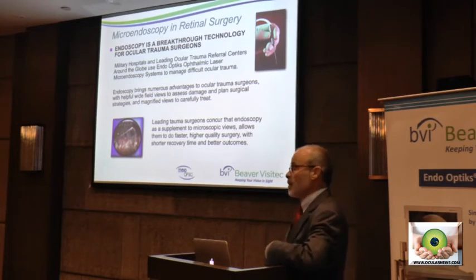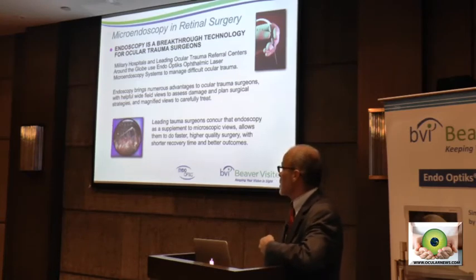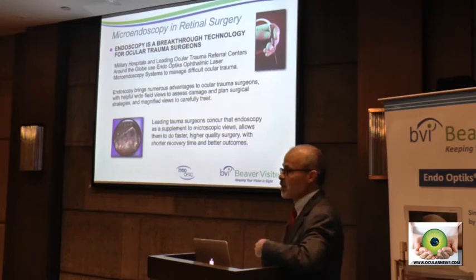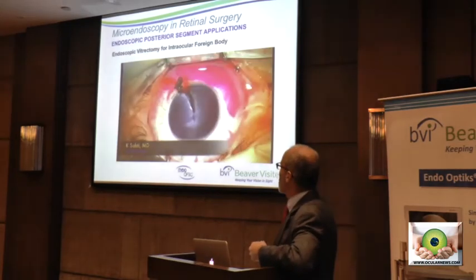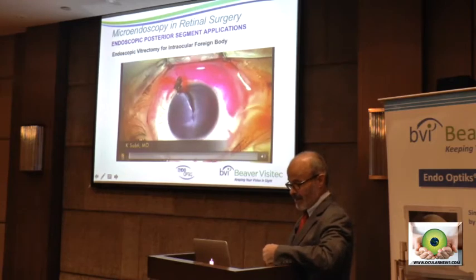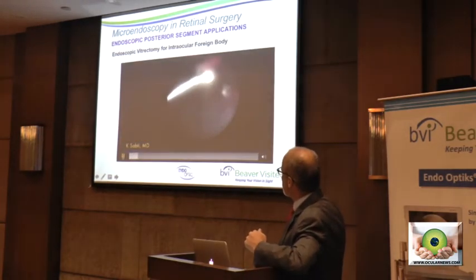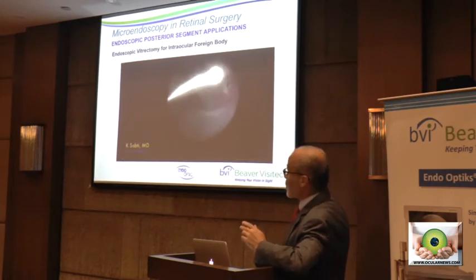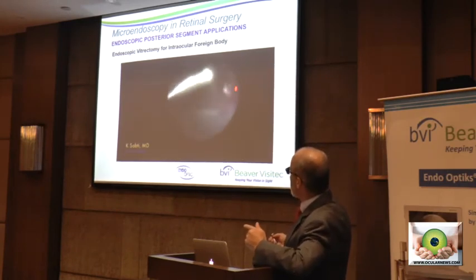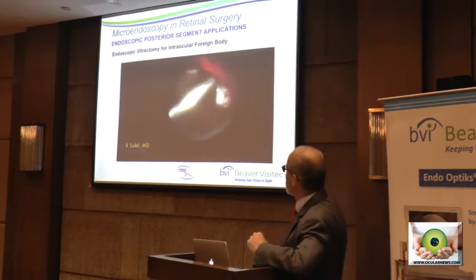Every Canadian military hospital, every Japanese, every UK, every German military hospital now has adopted endoscopy for these super challenging trauma cases. This is a short film, hopefully this will play. This is by Khalid Al-Sabti, Professor Al-Sabti from Kuwait University. This was a six-year-old child who had an air pellet gun bullet. His brother shot him in the eye.